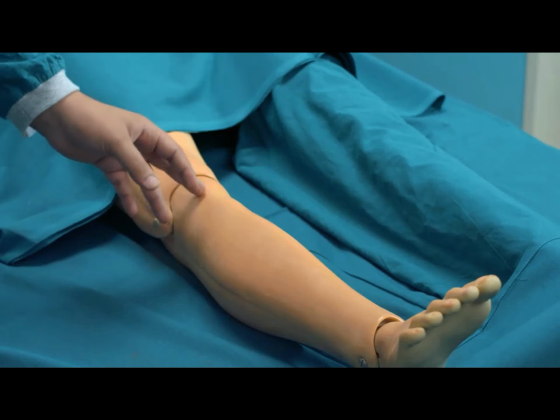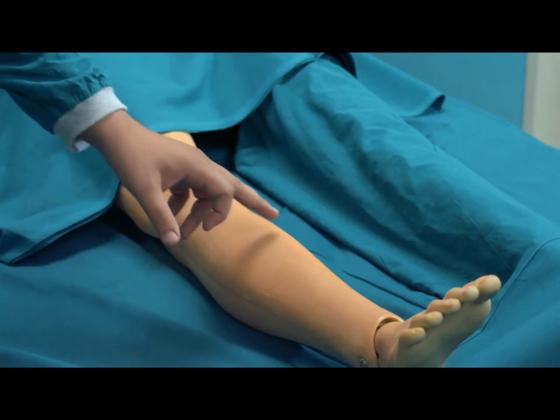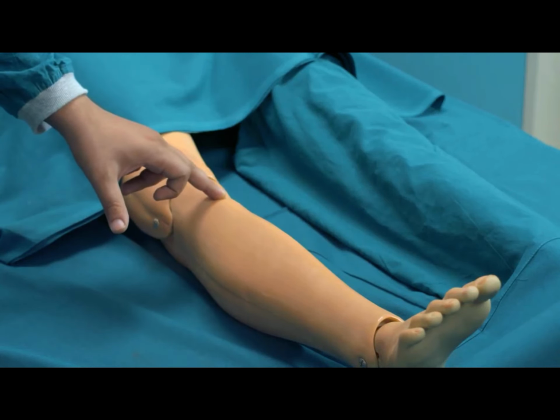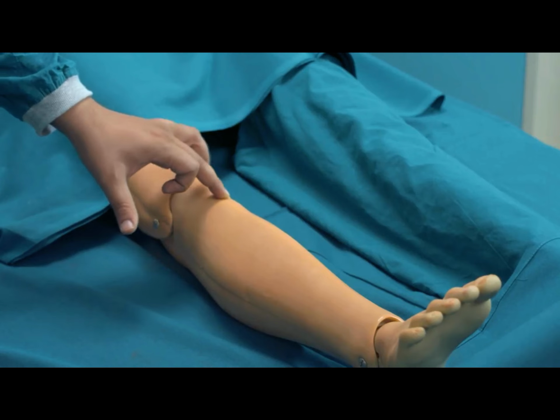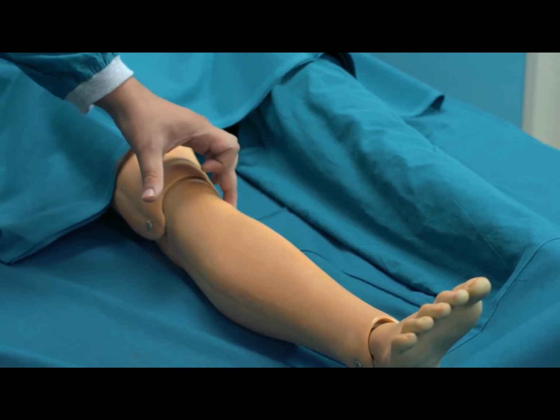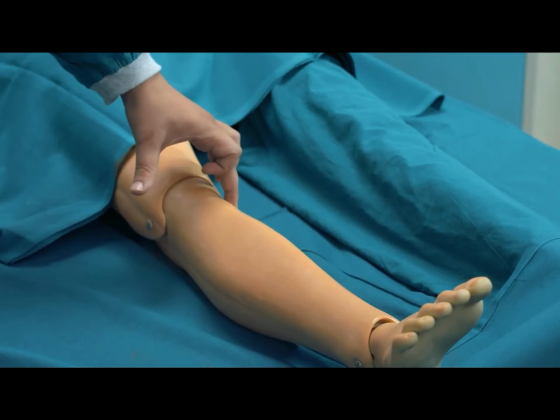Now, to locate the proximal aspect of the medial surface of the tibia, first trace the tibial tuberosity. After tracing the tibial tuberosity, 1 centimeter below it is the preferred site for the intraosseous access.